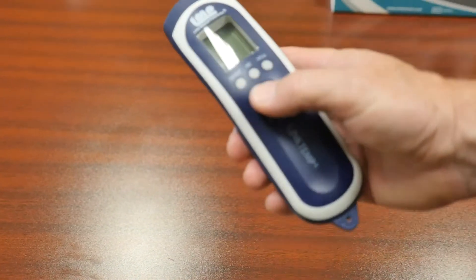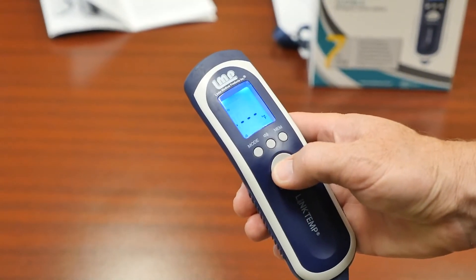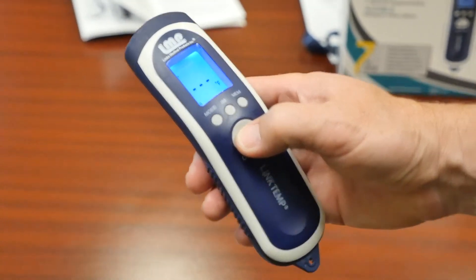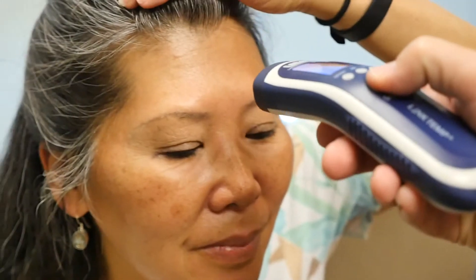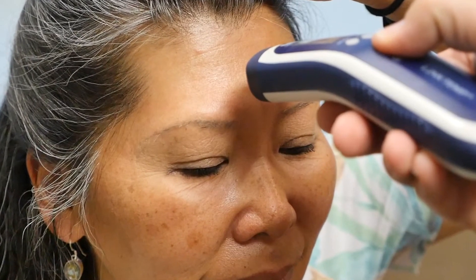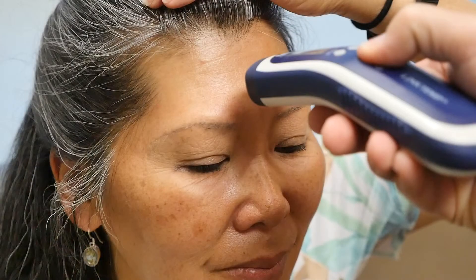Press the on/scan button to power on the thermometer. When the device is ready, the LCD screen will turn blue. Position the thermometer about 1.2 inches to 2 inches from the patient's forehead. Move any hair out of the way before taking a measurement. Also, if the forehead area is or has been covered with sweat, makeup, or a hat, first clean and dry the forehead area before taking a measurement.